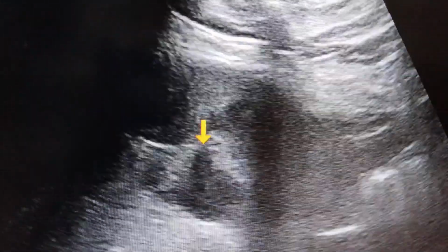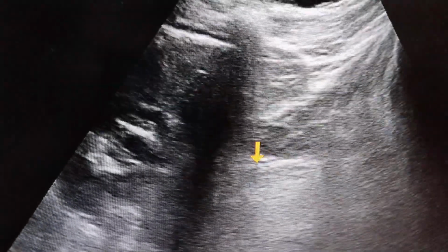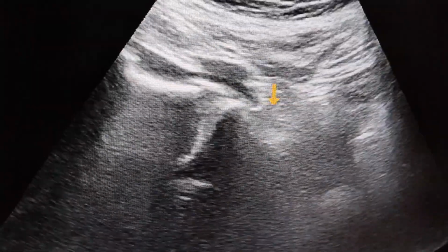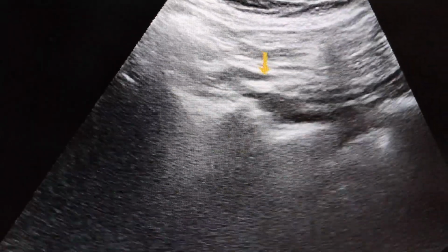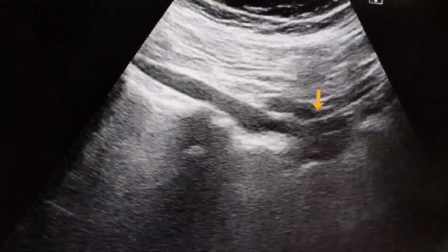and here we can also appreciate hydronephrosis. This one is the ureter, so hydroureter is also present. So there are bilateral hydronephrosis and hydroureter. These are the iliac vessels, and this is the ureter we can appreciate. It means the hydroureter is still present up to the iliac vessels.